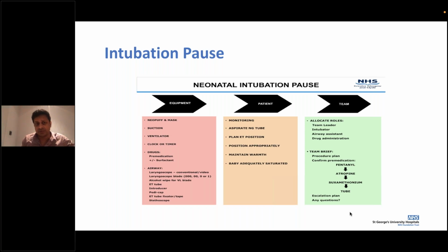You've checked all your equipment, including the mask, who is going to scribe, who is going to prepare the medication, what is the purpose of intubation, and having an effective nasogastric tube. Because you're providing bag and valve mask ventilation, you want to deflate the tummy on a regular basis.